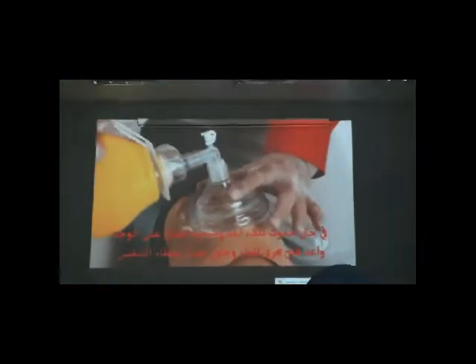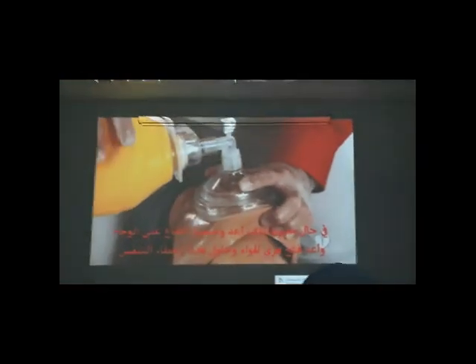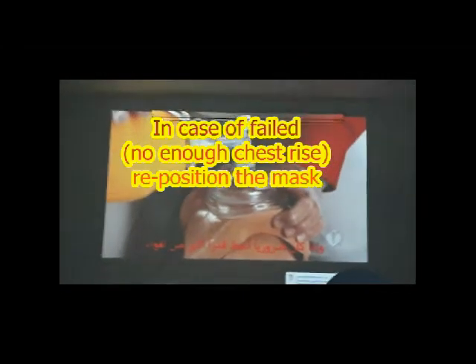Squeeze the bag with your other hand or push it against your leg or body. If the chest does not rise, readjust the mask, reposition the head and neck, and attempt to ventilate. If necessary, administer a larger amount of air.